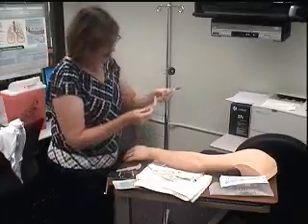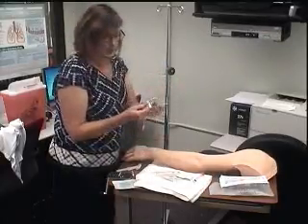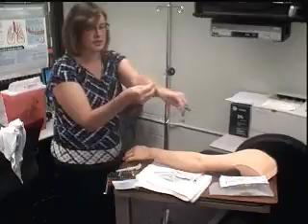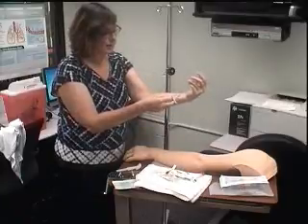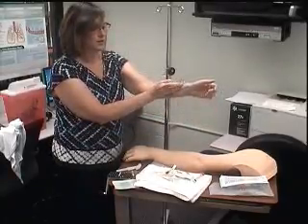You can see a saline lock that has an extension tubing that looks like this, or this, or you may see that the saline lock part of it is just this part. This goes into the IV like that. I'm putting an extension tubing on it so that this part will go into the arm, and this part is more free, which I'll tape down.